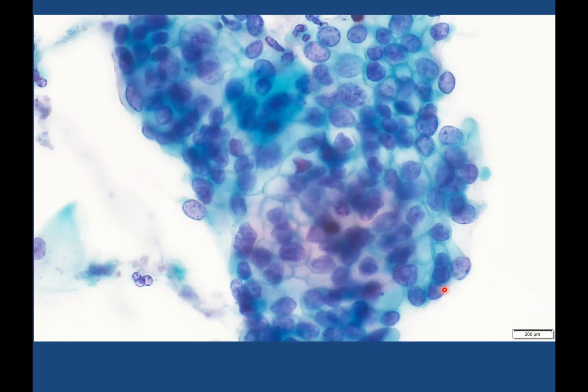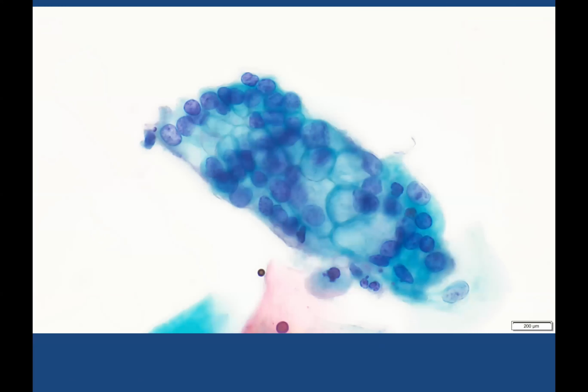And if we go right over to this nucleus, it's subtle, but the nuclear membrane is exaggerated, as you can see here. So I think we have an abnormal chromatin pattern and arrangement, and this is intestinal type of high-grade CGIN, and was shown on histology to be that.